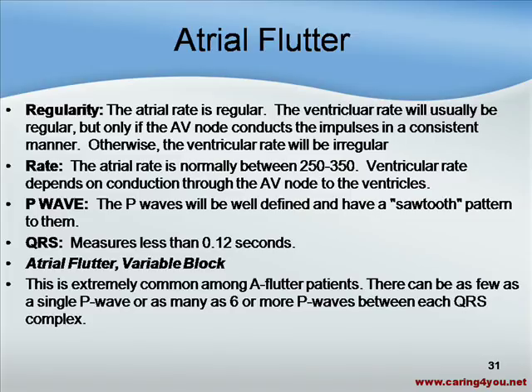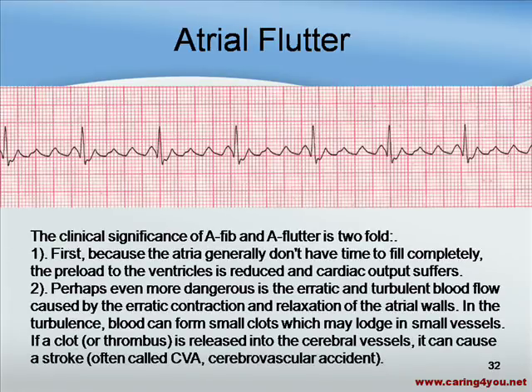Atrial flutter with variable block is extremely common among atrial flutter patients. There can be as few as a single P wave or as many as six or more P waves between each QRS complex. On the strip here, we see one, two, three, four P waves between each QRS complex. This is what is known as atrial flutter.